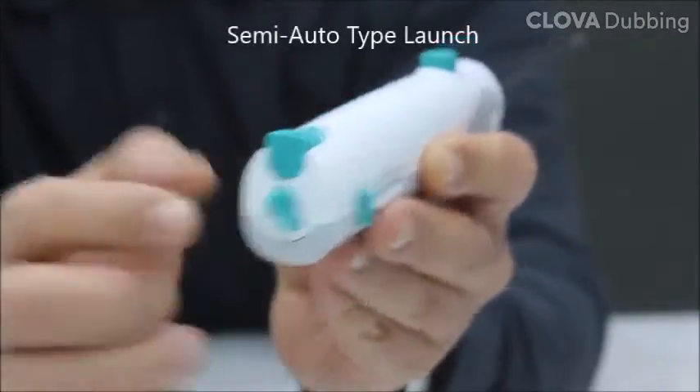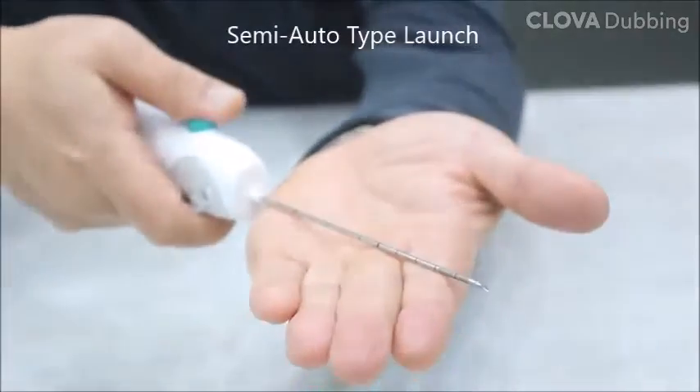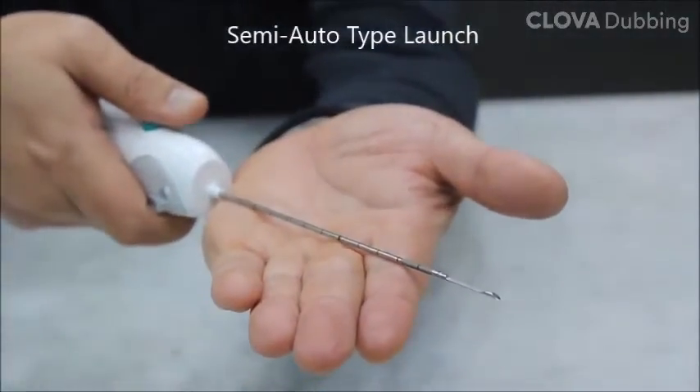This is how the semi-auto works. For semi-auto, press the launch button twice to complete the tissue extraction.